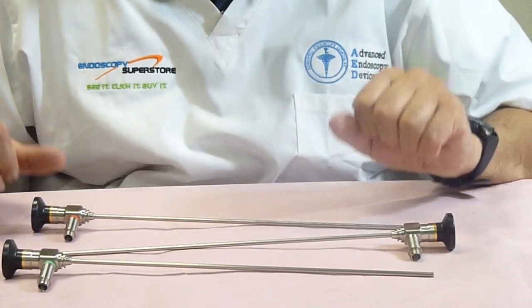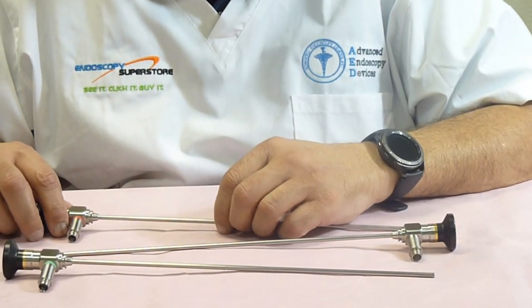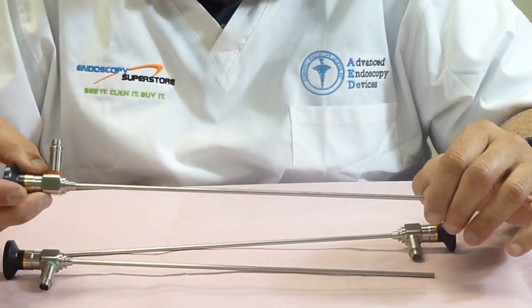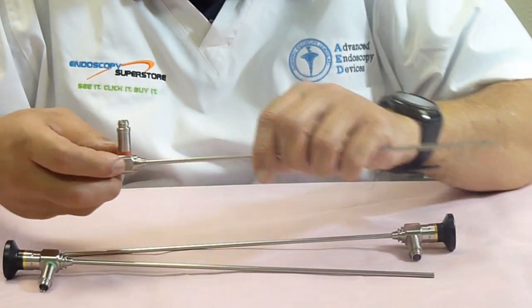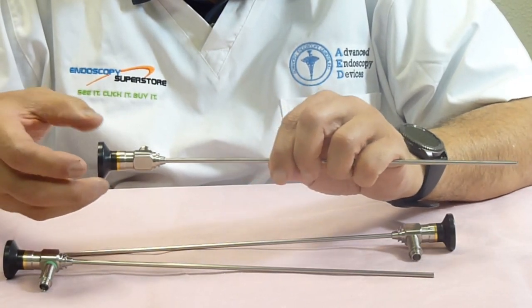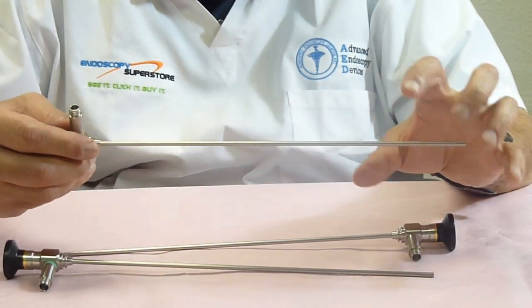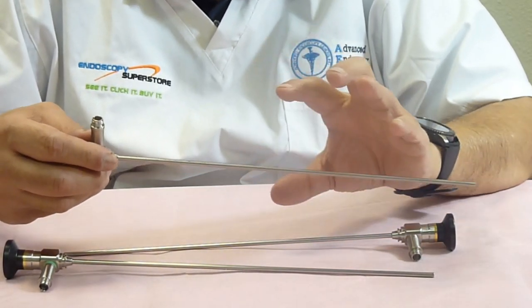At Endoscopy Superstore, we have a wide variety of scopes that we manufacture. These scopes are assembled in the USA from German optics. The bodies are all made of stainless steel, and we use high-aperture light fibers with rod lens systems that give you a very bright, sharp image.